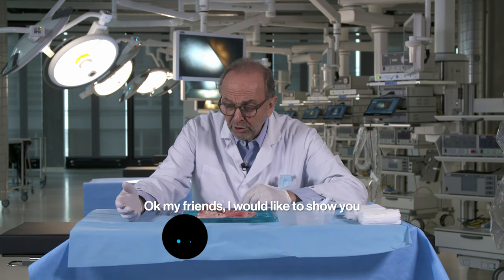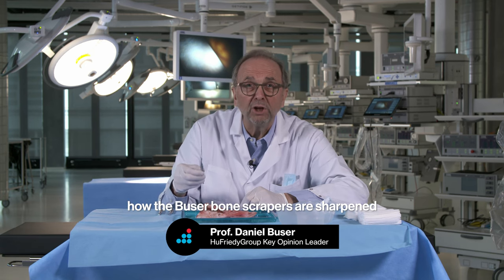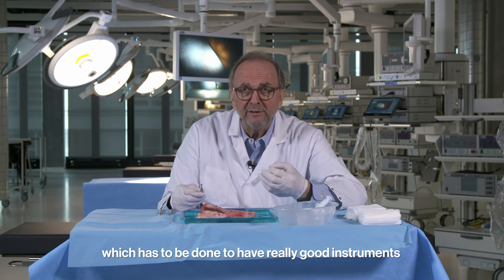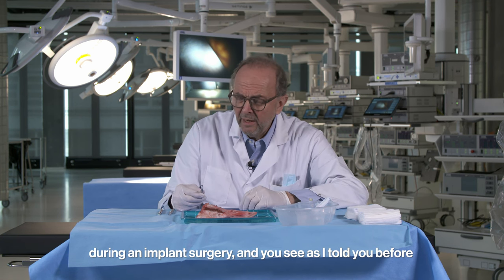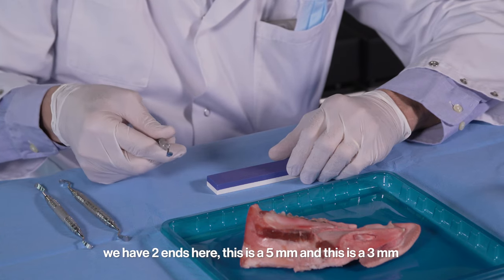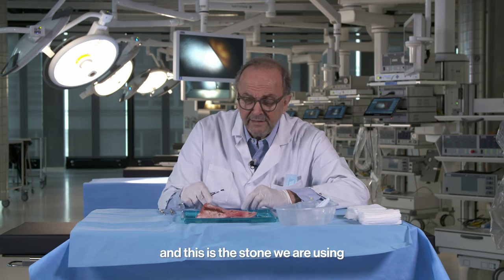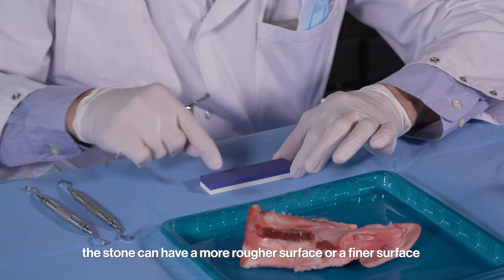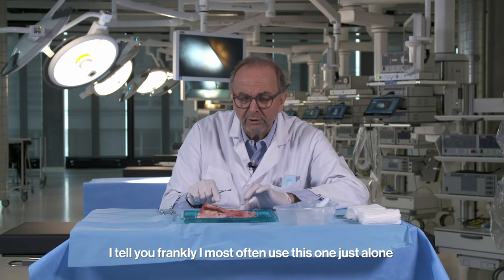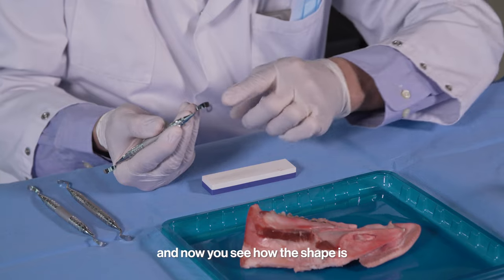I would like to show you how the boosal bone scrapers are sharpened, which has to be done to have really good instruments during implant surgery. We have two ends: this is a five millimeter and this is a three millimeter end. This is the stone we are using — it can have a rougher or a finer surface. I most often use just this one.